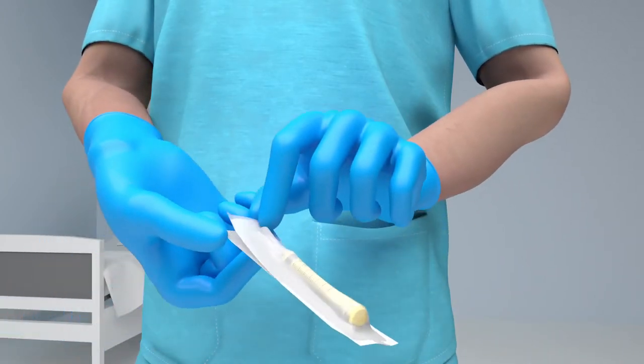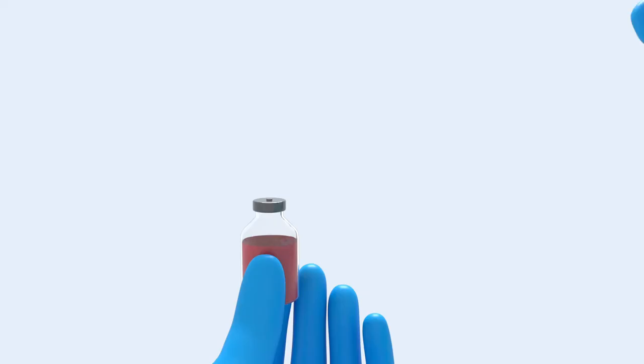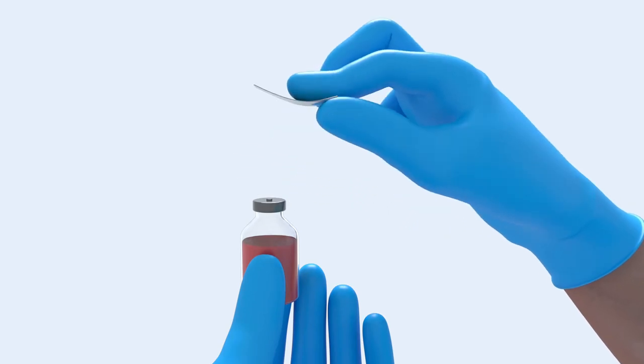Remove the syringe by peeling open the sterile blister pack. Remove the protective cap from your medication vial and cleanse the top.